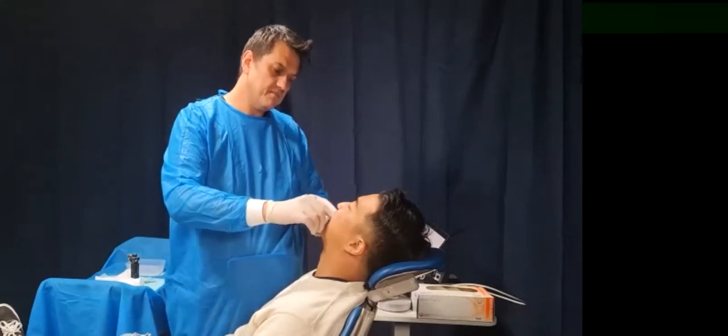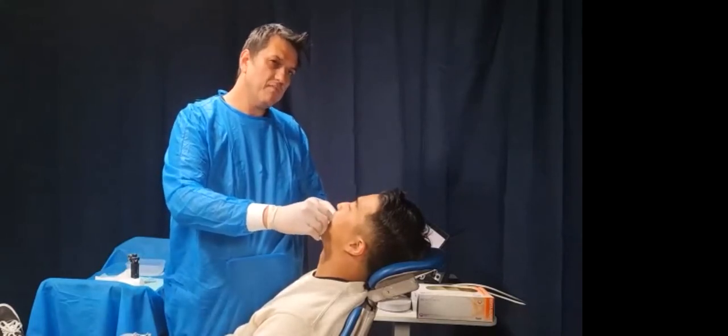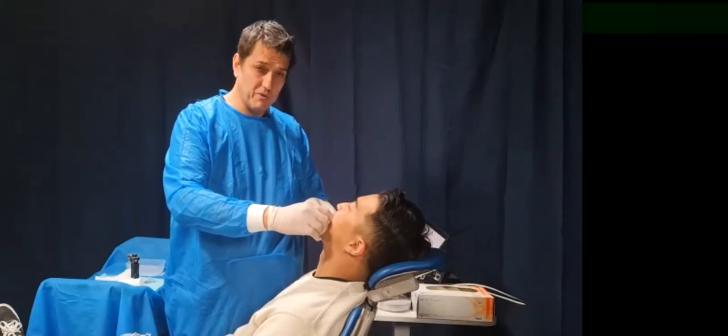Again, closing together. All right, I just want to do one more picture of our cameraman. Come in one more time, please, sorry. Just having a look there. If you can just move the camera around to this side as well. You can see that I've got the teeth nice and clear. Now that's fantastic, thank you. I think everyone can see that now.